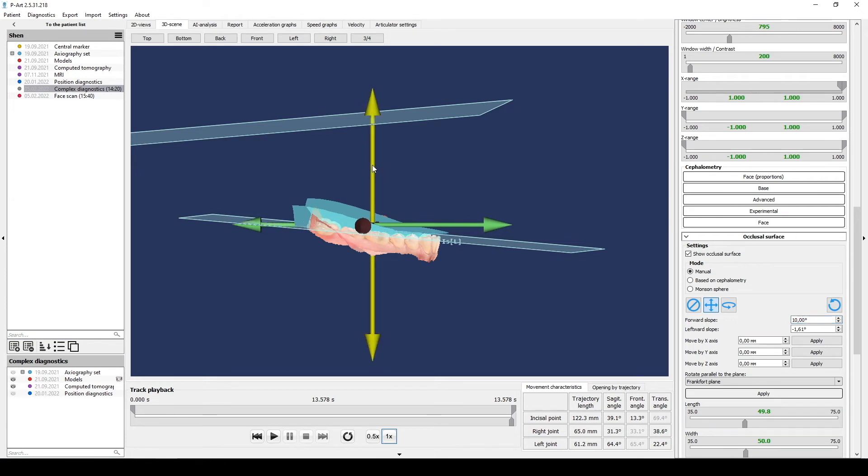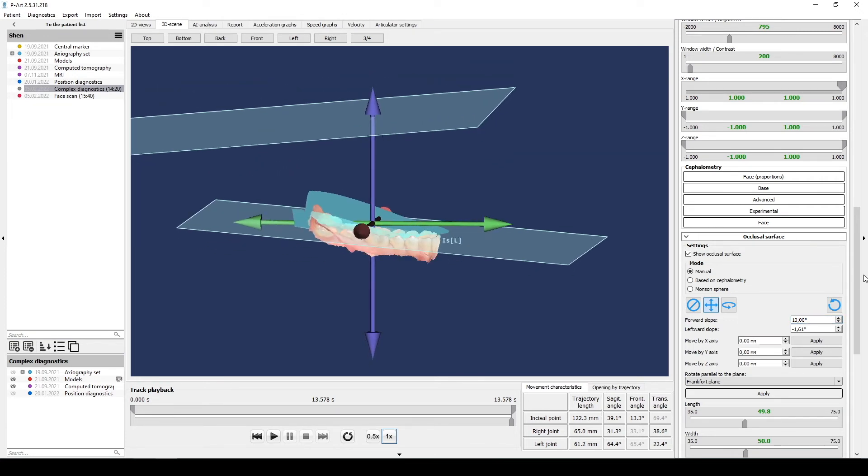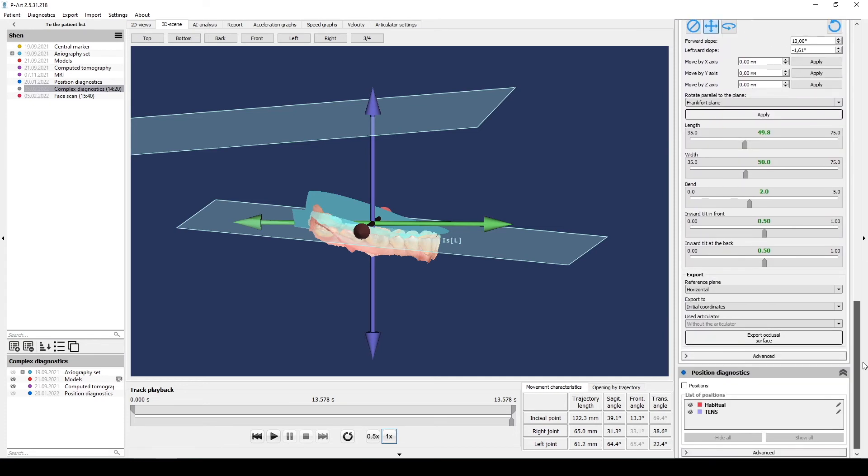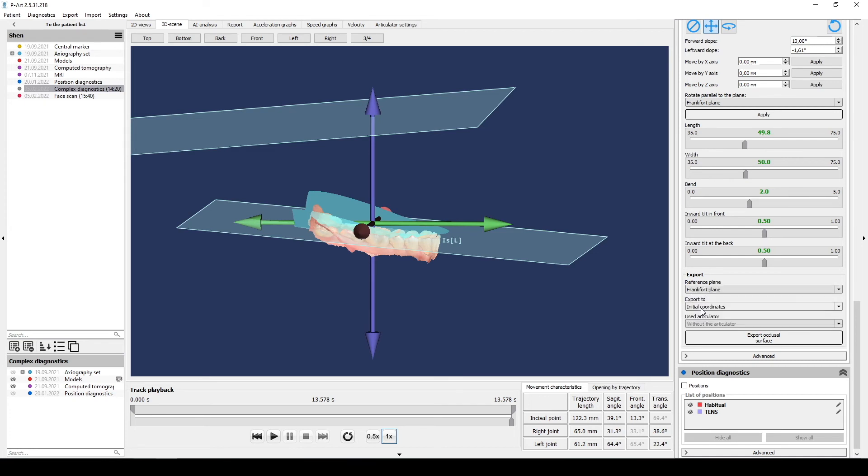Now we can export it like a 3D object. For export you need select the subsection of export. Then select what kind of reference plane you need. Very important. Reference plane should be the same as reference plane for exporting individual models.